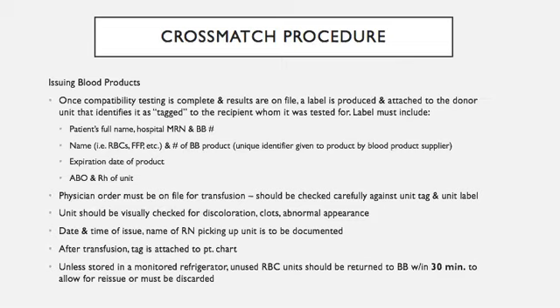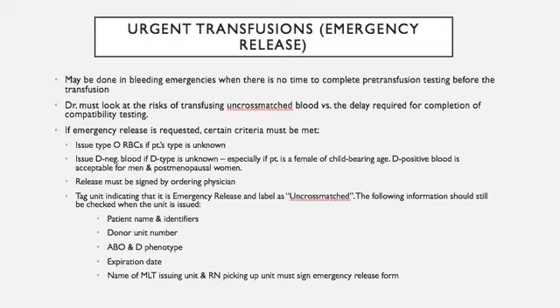So whatever the cost of that unit was goes in the trash also. And I will say the standard is 30 minutes. I think our hospital policy now is 20 minutes, so that might be somewhat hospital specific.